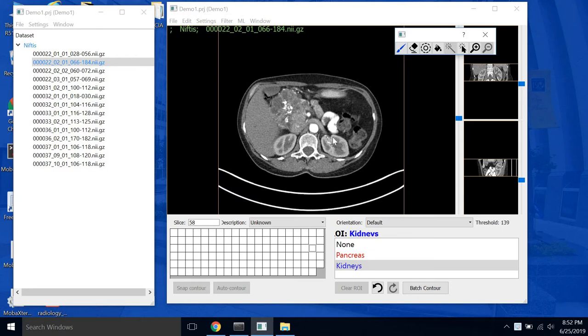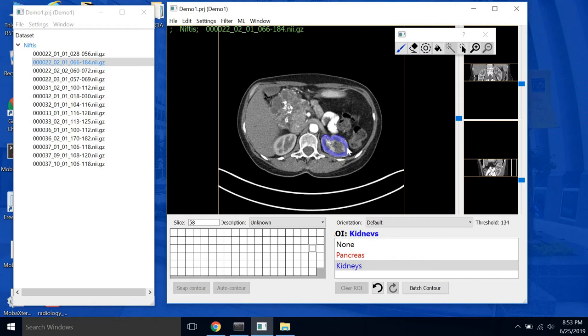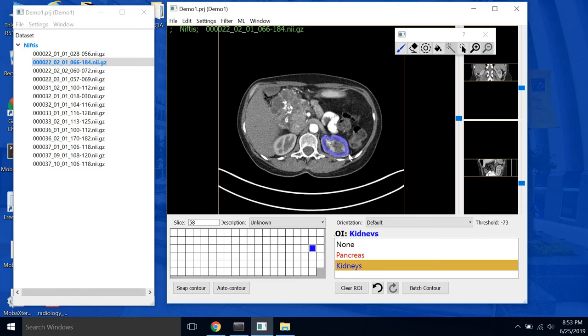So if we click and hold the left mouse button here, that's how we get started tracing. So it's essentially the same thing as Microsoft Paint. So hold the left mouse to trace, hold the right mouse button to erase.